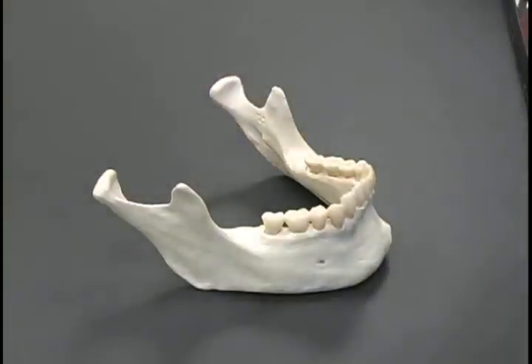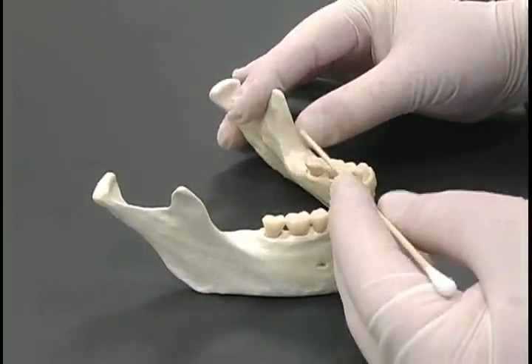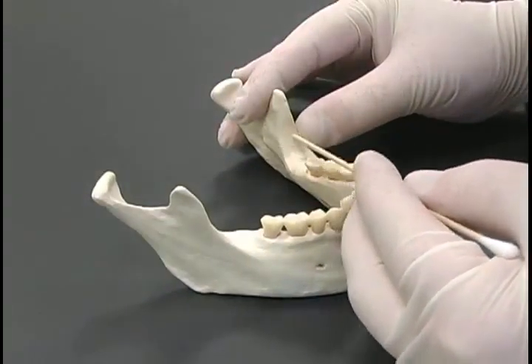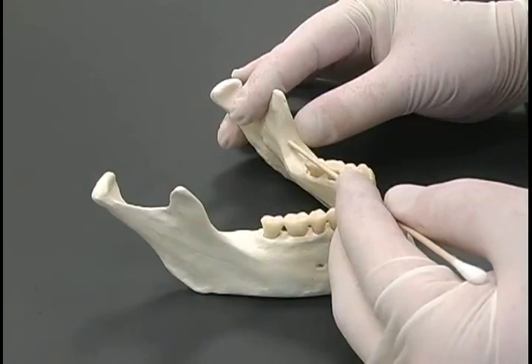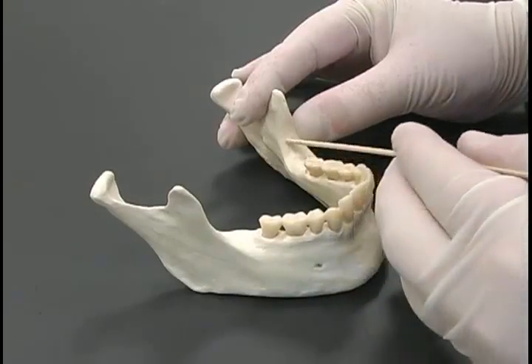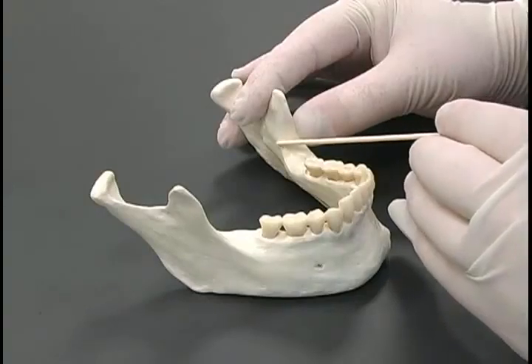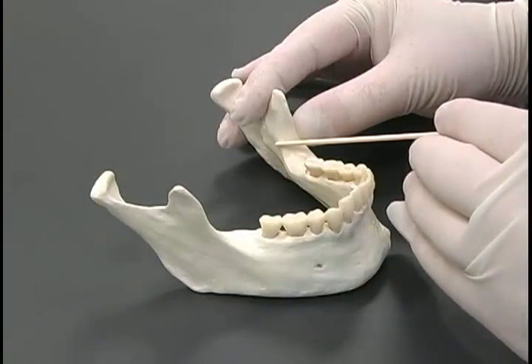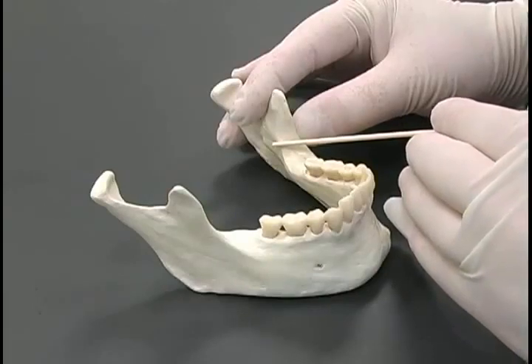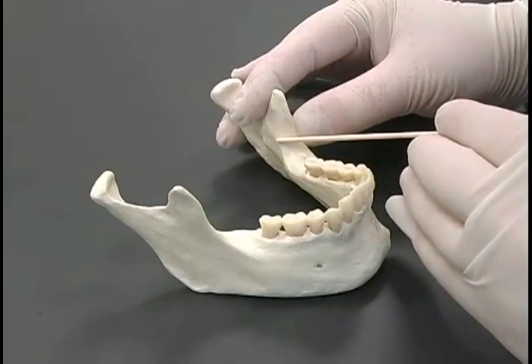Sometimes in certain patients, the anatomy of this region is such that the mandibular ramus may be quite wide, so going five millimeters medial to the external oblique ridge means that you need to move all the way over to navigate past the internal oblique ridge. Sometimes you will need to bend the needle a little bit to achieve passing the internal oblique ridge.